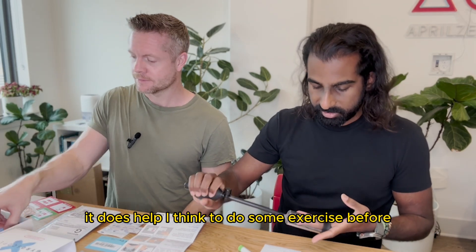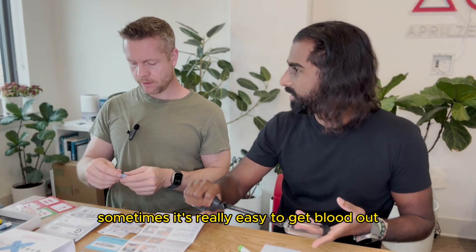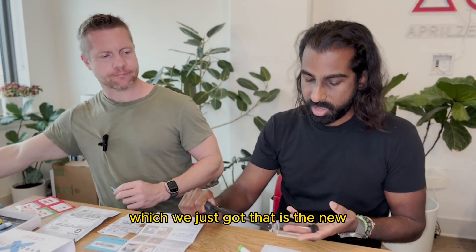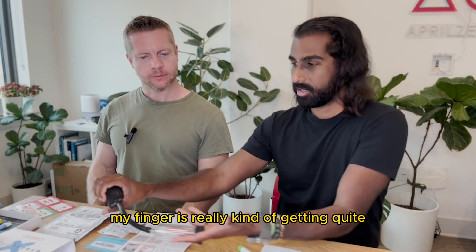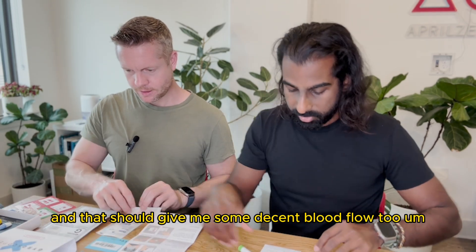It really does help to do some exercise before because sometimes it's really easy to get blood out and other times you're sitting there for 10 minutes struggling. So I'm going to try this pump thing — you can see my finger is really getting quite a bit darker than the other one. Really pulling the blood out, feeling it right now. That should give me some decent blood flow.